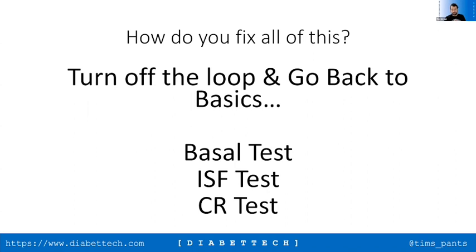If you're achieving a time in range that's 75%, you're getting the same levels as the commercial systems are getting. If you're getting 80%, you're getting better than the commercial systems are getting. The key question for you is, are you happy with what you have? And if you aren't happy with what you have, and it's causing you either anxiety or issues related to things moving up and down a lot, then this is what you would need to do to go away and have a look at it.